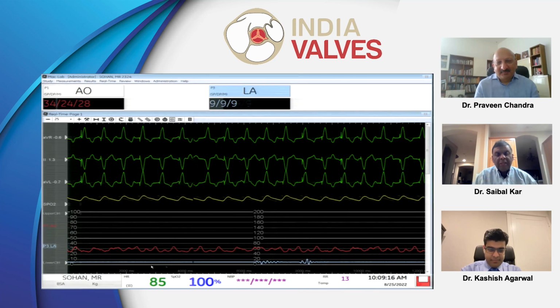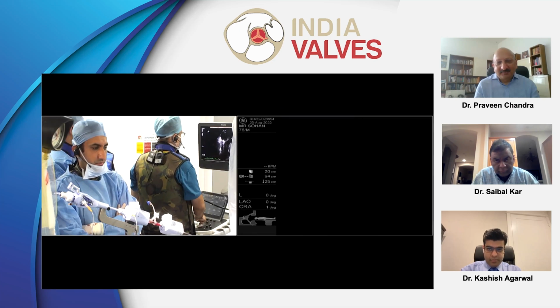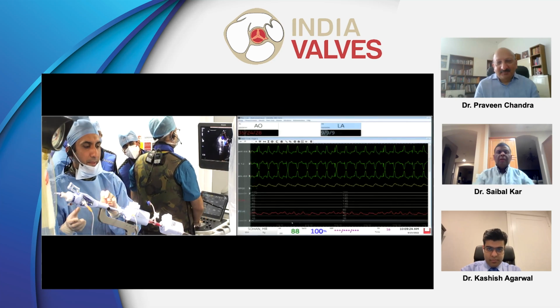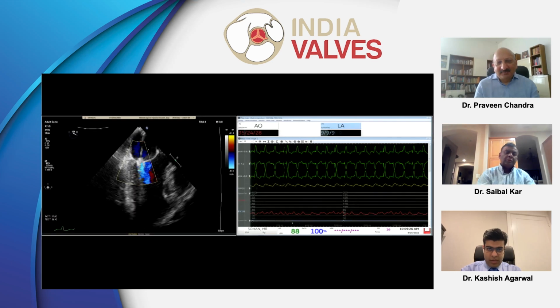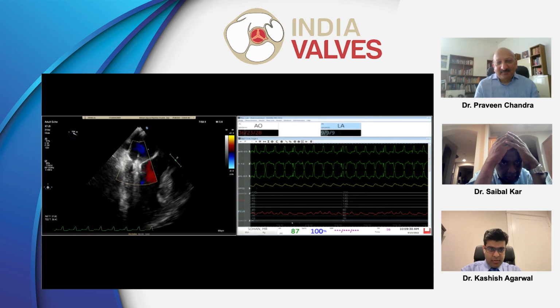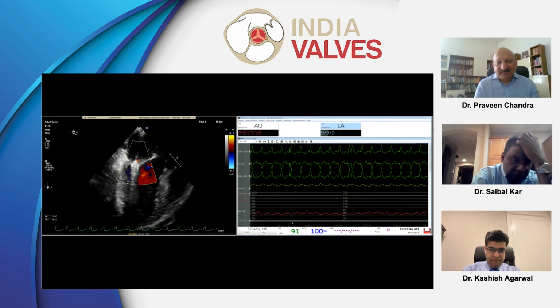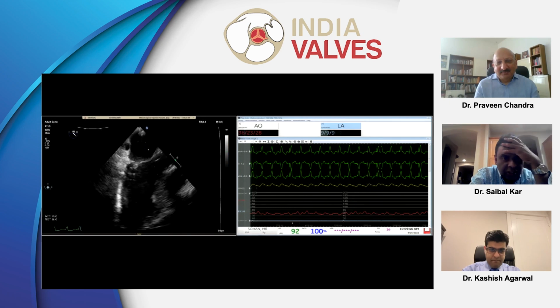Now can I see echo? Show the echo and hemodynamics both, please. Echo, hemodynamics, and fluoro. Echo is more important. Yeah, echo. Yeah, we need to. Very good. There's no MR. Just interrogate the MR now, Prashant. Go back and forth. I don't see any MR, right, Prashant?